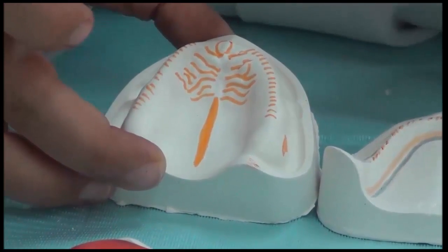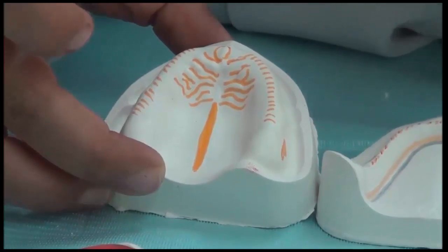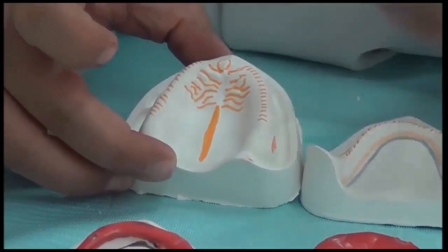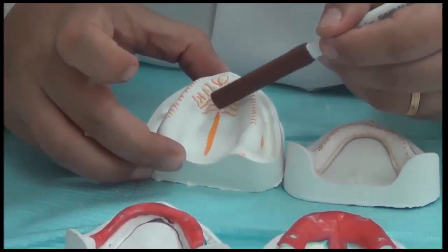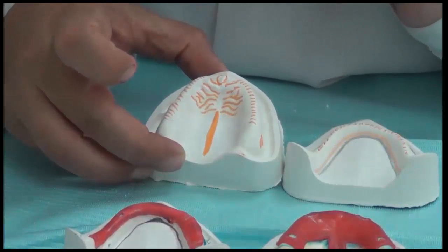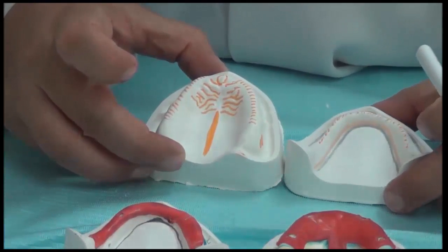So we understand that now, for a denture to be successful, we should compress the tissue beneath it and make these areas in orange all relieved, even under pressure. So this is what we call selective impression technique.